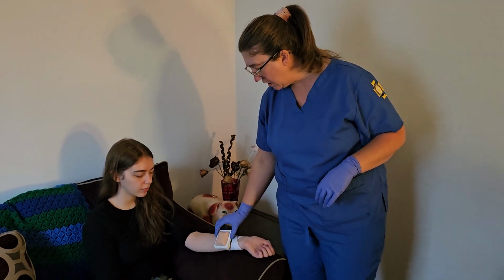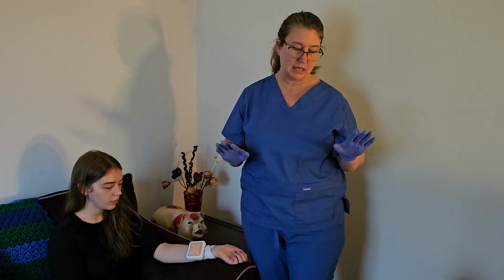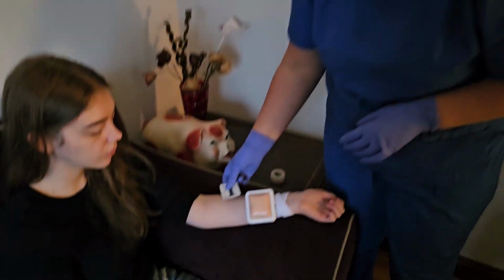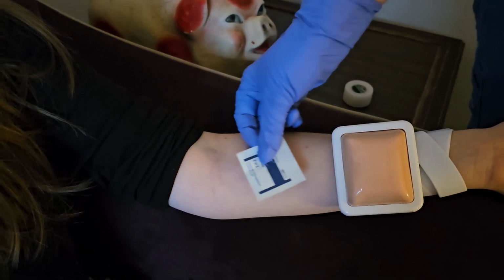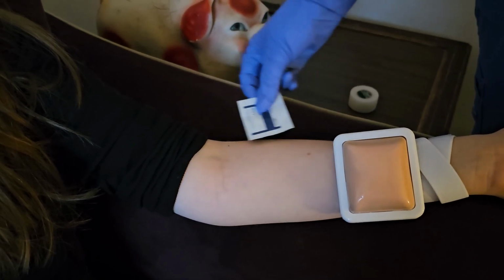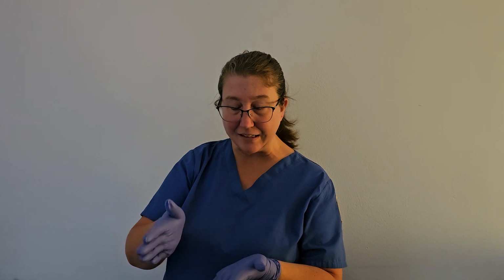Okay. So what we do next is we're going to clean the site. We get our antimicrobial wipe, and we are going to clean the site. We are going to go in a circular motion from the inside out in a very firm wipe. Okay, inside out. And we're going to let that dry naturally. Of course, we're not going to blow on it, and we're not going to fan it. We're just going to let it dry naturally.